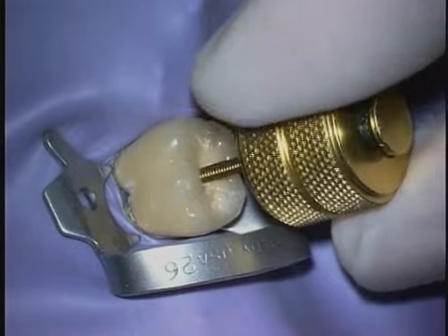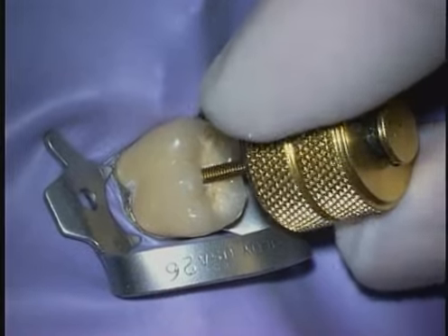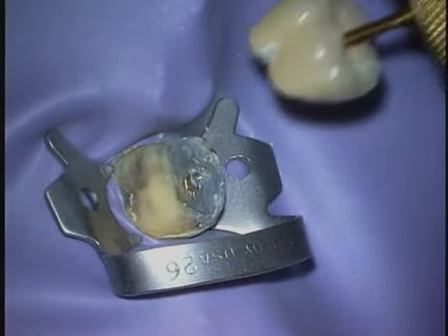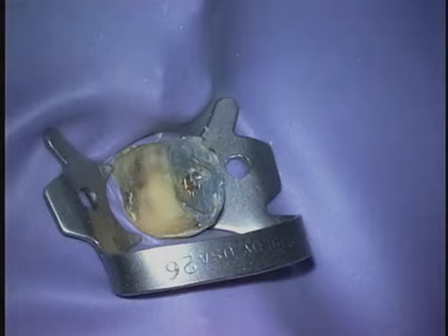In some instances, if this tool strips the threads and pulls out, another hole can be made at another location on the occlusal surface to facilitate the removal process.